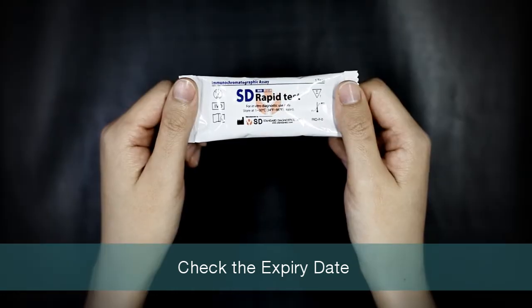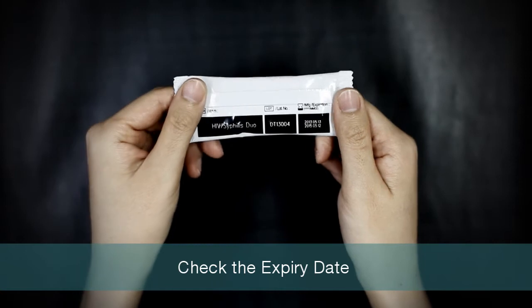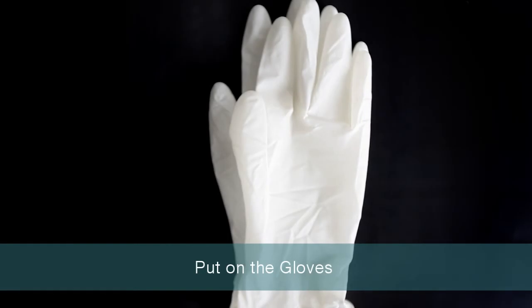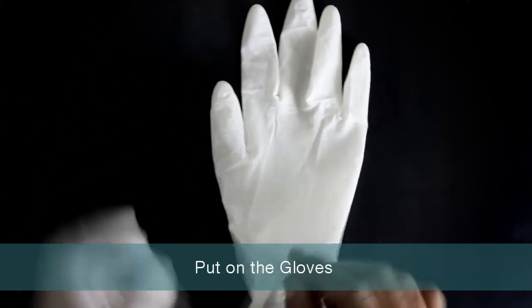Let's begin the test. Check the expiry date on the back side of the test pouch. If the expiry date has passed, use another kit. Put on the gloves. Remember, use new gloves for each patient.